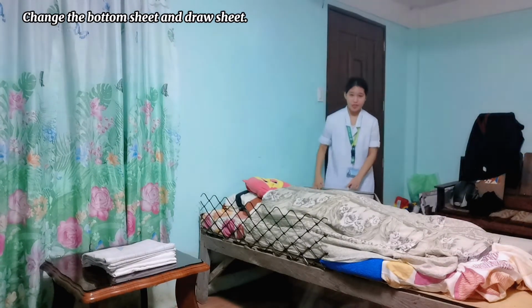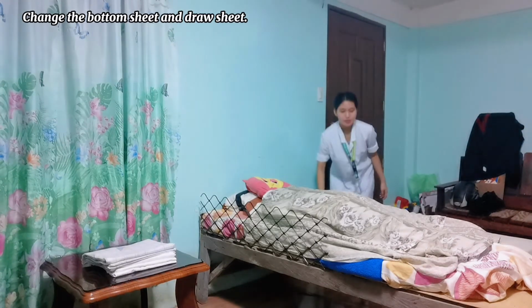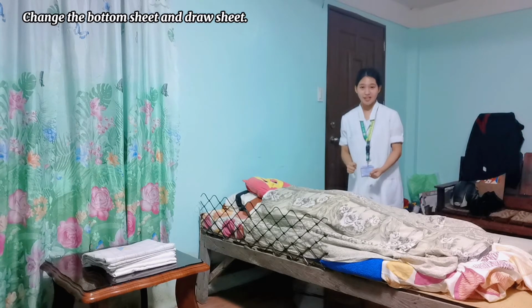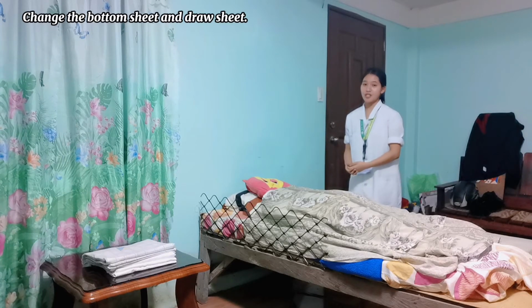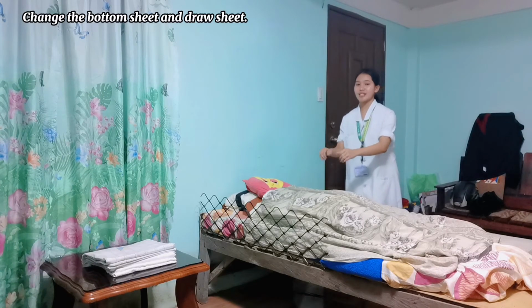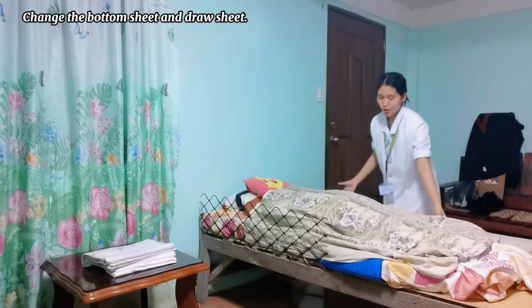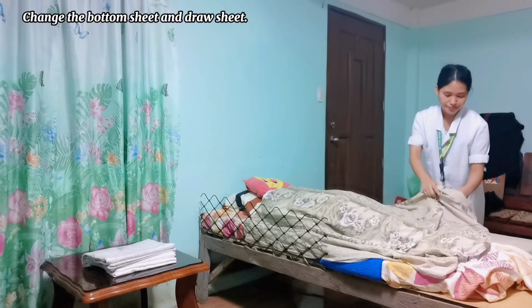So I'm going to lower the side rails. And then we will be instructing the patient to again cross his legs and position his arms and roll over to that clean side of the bed. So sir, you will be crossing your legs.